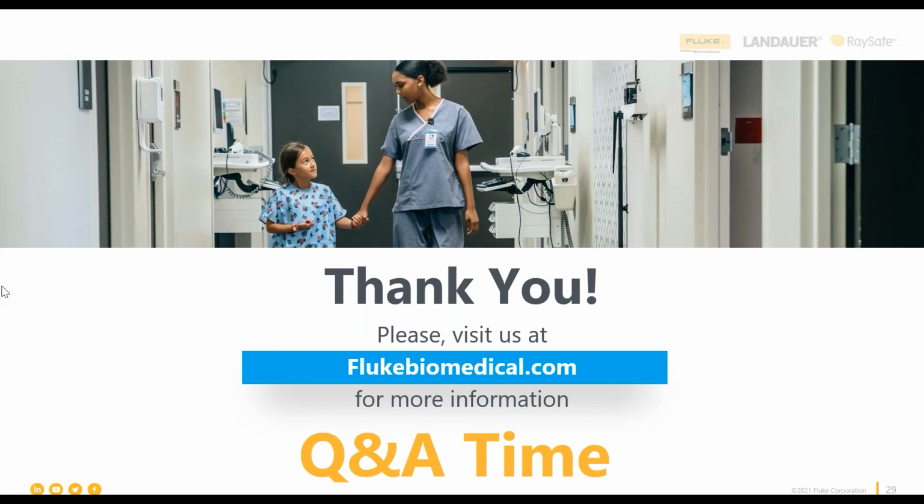Those units with monopolar modes will either have a plate or an adhesive pad. There are also tests in a bipolar test that will require the use of a pad or a plate as well. So do check your service manual. Again, these units that do need a CQM test might be slightly different with every brand and model, so I would point you back to the service manual to see if you have to do that.